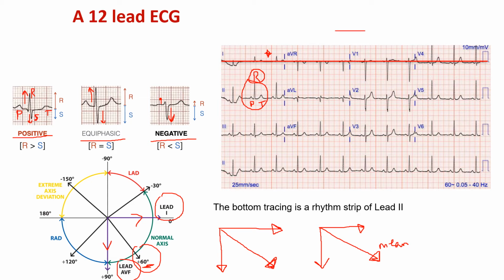If you see on your EKG something like this, going upwards, that is a positive deflection. And a positive deflection is usually when your vector is headed towards the positive electrode. If you get another line right here, that means no deflections are taking place.